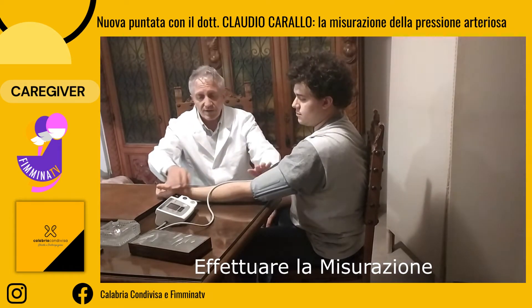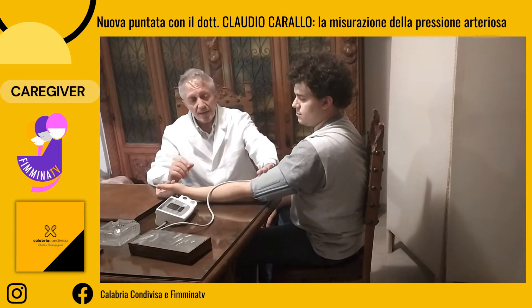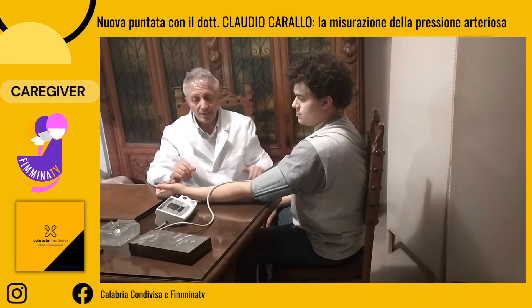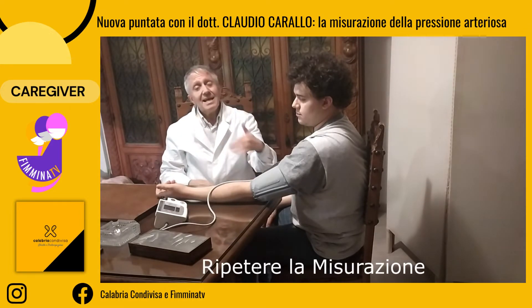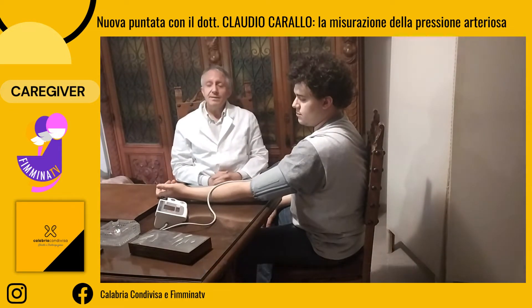Alla fine della misurazione, durante la quale non dovrete toccare il braccio, perché altrimenti falserete la misurazione pressoria, mi raccomando, il paziente non dovrà parlare. Potrete anche ripetere la misurazione, ma mai prima di tre minuti.